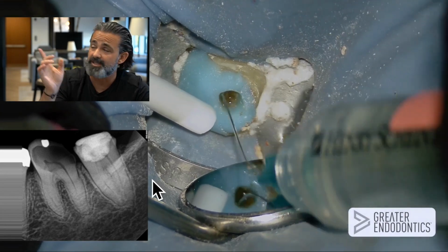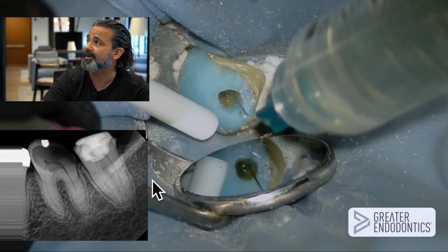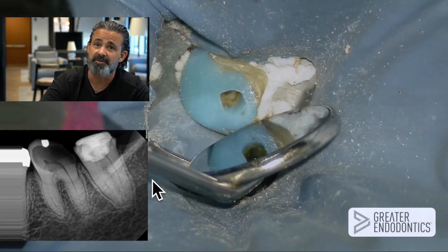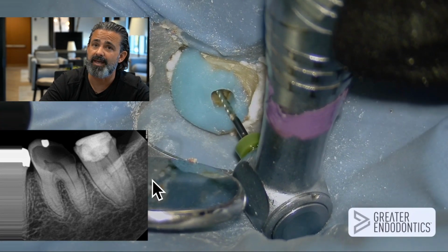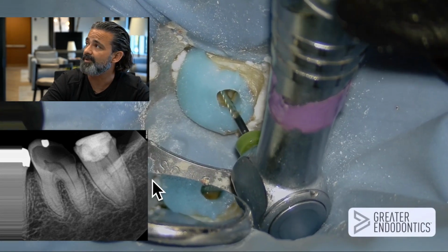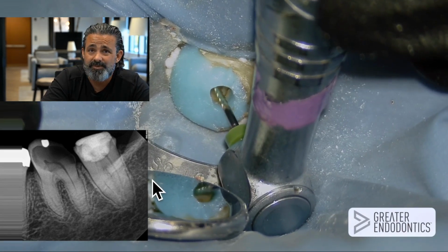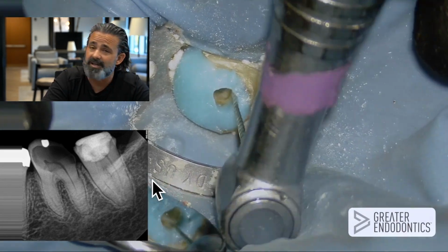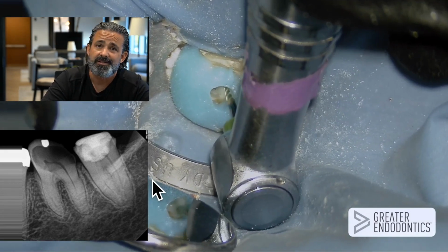This is in my syringe full strength, whatever full strength is, the Clorox bottle. Let's say it's under 6%. And then I take the 1506. And I've pre-measured this on my cone beam, and I do trust that a lot. I do cone beams on every case, and because of that, I measure on a cone beam on every case. And I try to learn from that.